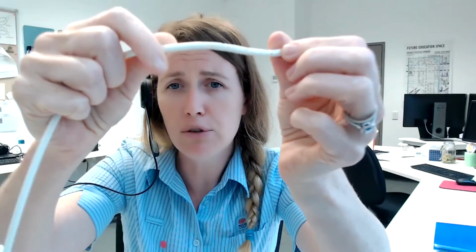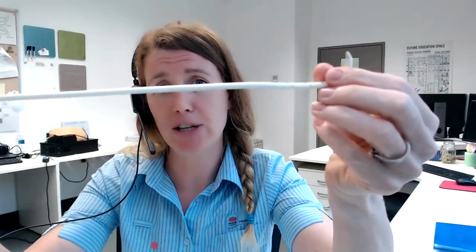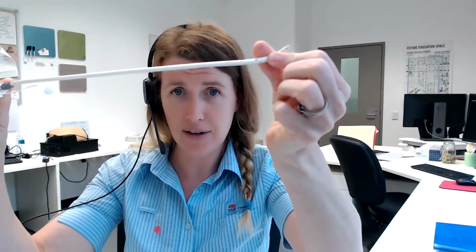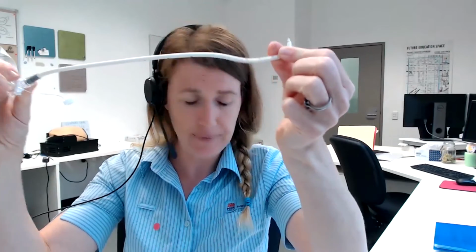So if your pleural fluid is thick, so if it's as a result of, say, a malignant pleural effusion, so maybe cancer, you might find that you get some debris, some thickness to it, so that might not be big enough. And if they're occluding, the medical officers may choose to put in a larger bore ICC. I don't know if that's focusing. I'm trying to get to focus on that.